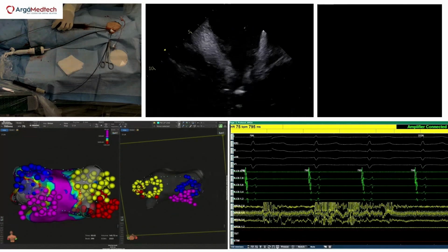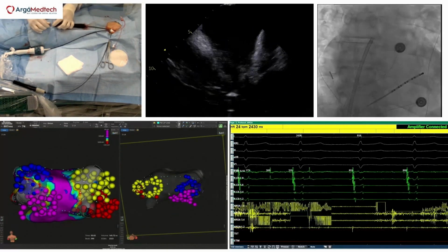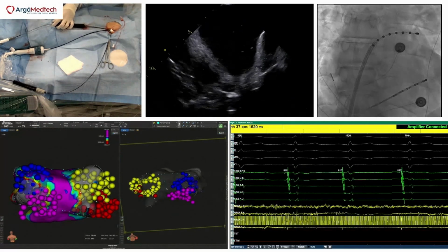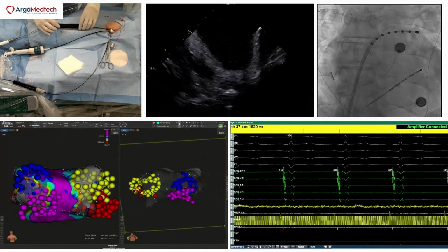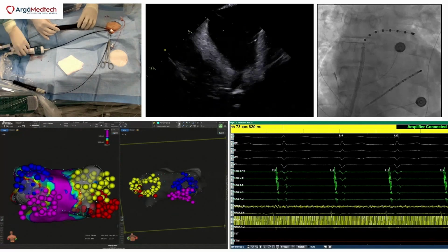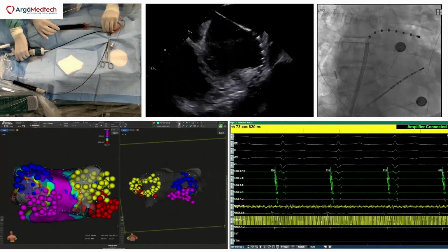And now what I want to do is anchor for the roof line. I'll try to anchor my catheter. So catheter goes up. Let's say here, we see that we are, let me see. Yes, you see we are in the left superior, but the next move should be something like this. Catheter is loose. Let me try now. Oh, good. It's a good contact. Do you see now, guys? We have pretty good contact.